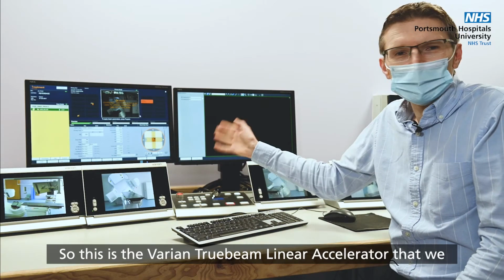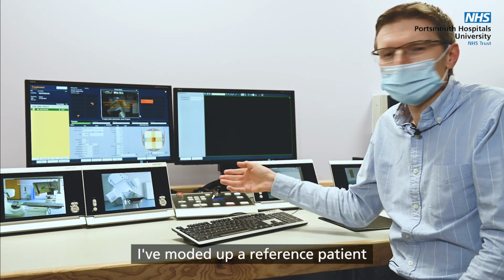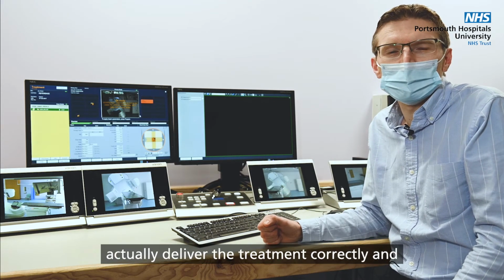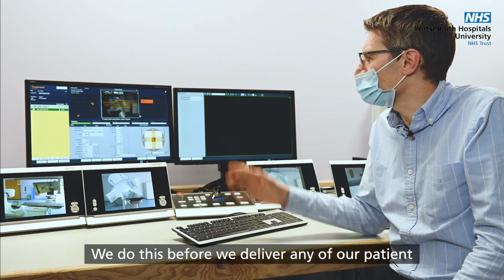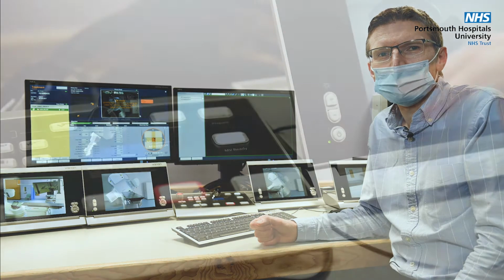So this is the Varian TrueBeam linear accelerator that we're going to deliver the treatment on today. I've loaded up a reference patient here, which is what we deliver before we treat any patients, just to check that the machine can actually deliver the treatment correctly and that the equipment we're using to measure the dose of radiation is actually working properly. We do this before we deliver any of our patient treatments routinely.